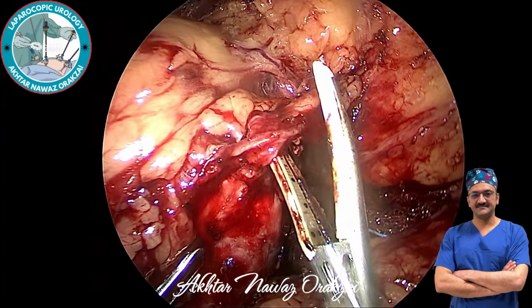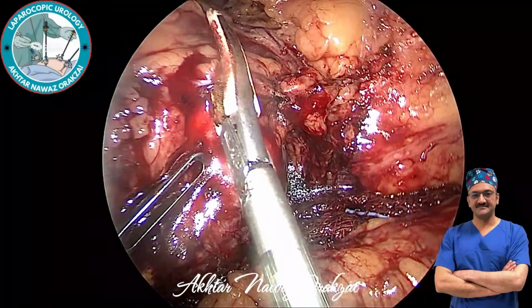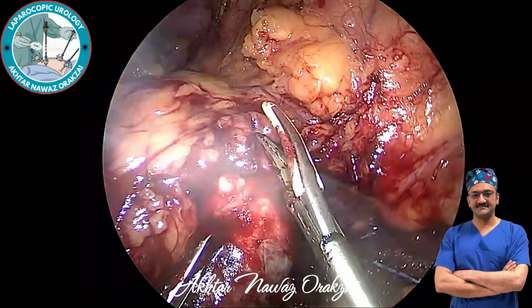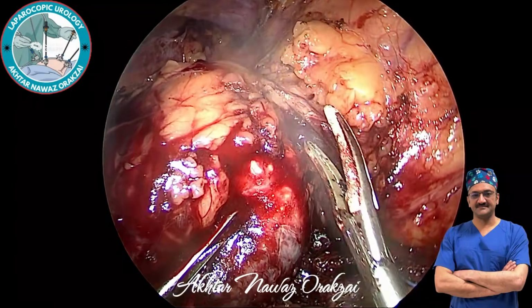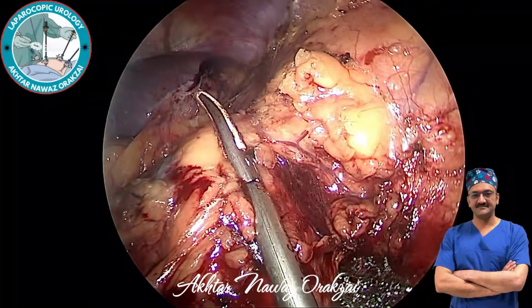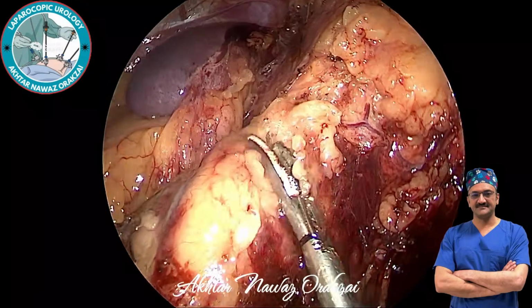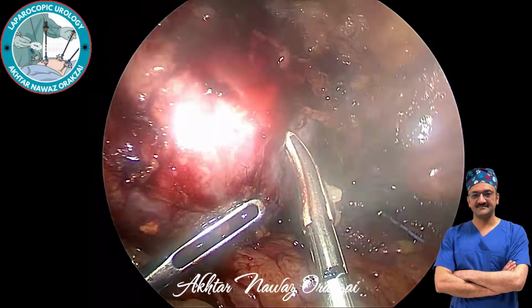So here you can see that this is the branch of the superior pole which was supplying the adrenal gland. There is another one, and you can see the branches of the superior polar artery, and we are dissecting away from those branches so as to avoid any damage to the arteries which are supplying the kidney.